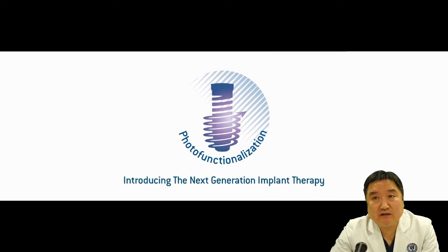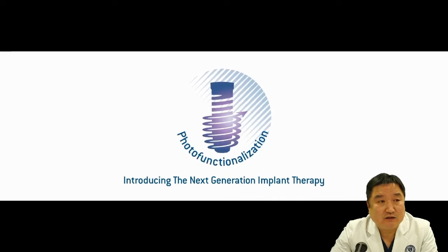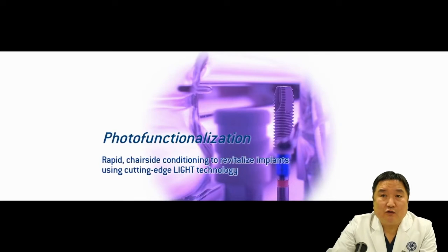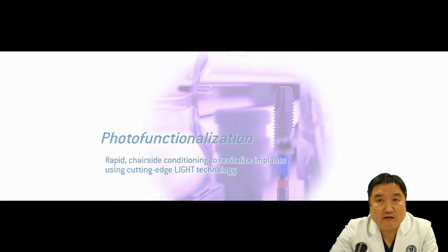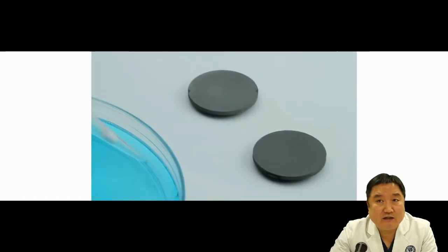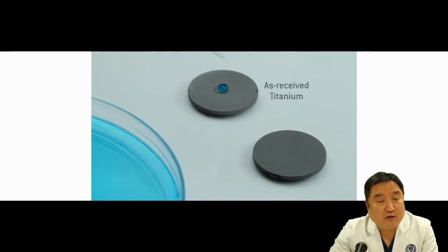To answer this question, I'm going to discuss photofunctionalization. This is a short video clip. The source of photofunctionalization is UV light. When you use UV light irradiation on the titanium surface, it will change the whole property of the titanium surface.